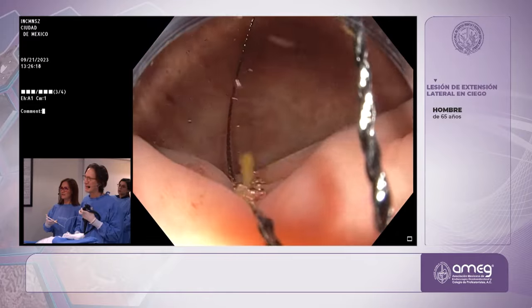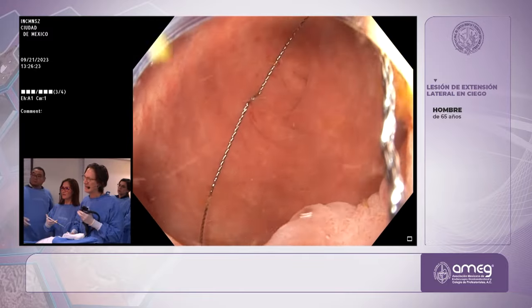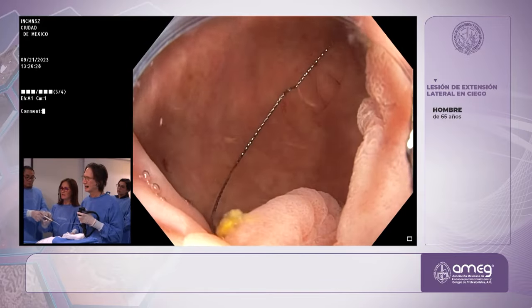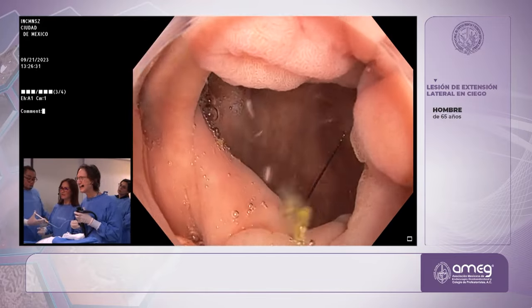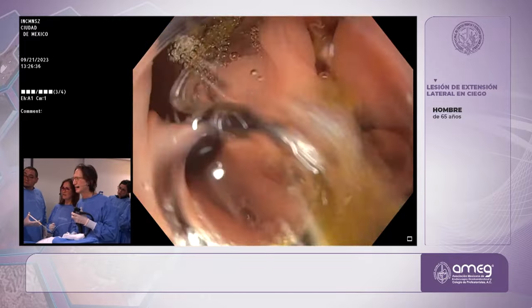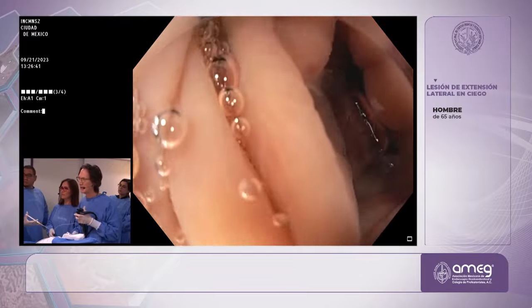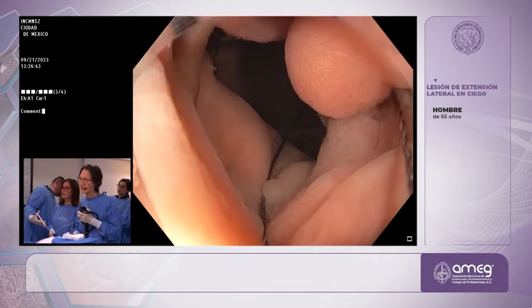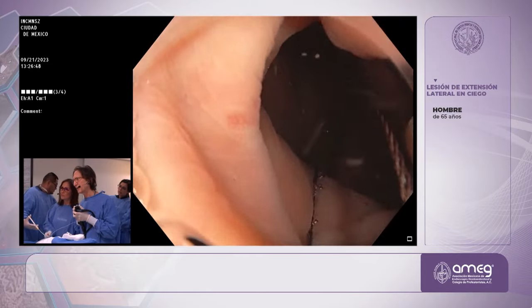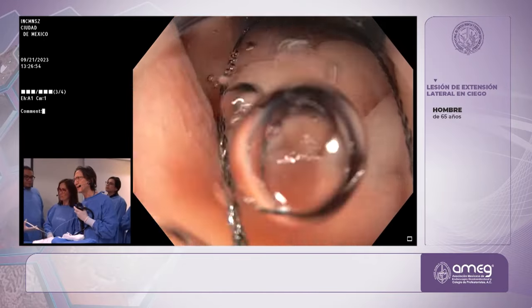Okay, now I'm just pulling back. And I'm just going to try to lay this snare down with the lesion at 6 o'clock. And I'm going to have an assistant also hold the scope when I ask. So not quite yet. So I'm going to bring the left edge of my snare to the left edge of the lesion. And I'm not giving any Buscopan or glucagon or anything because I like the contractility. I'm going to take advantage of that. But as soon as I see that edge of the snare on the left edge there, then I'm going to pivot it over to the other side.